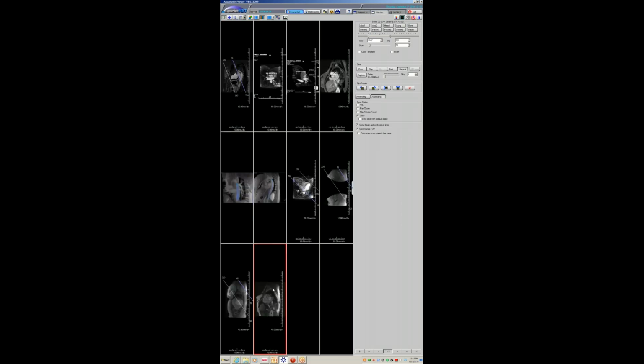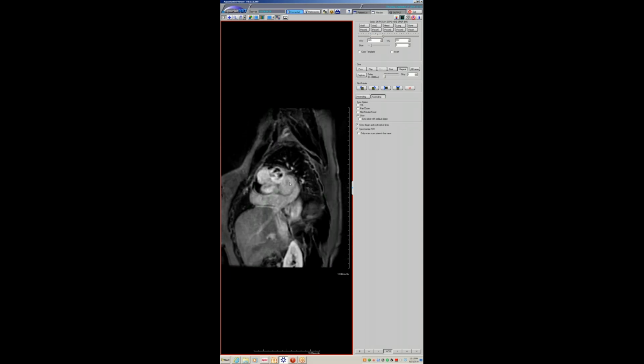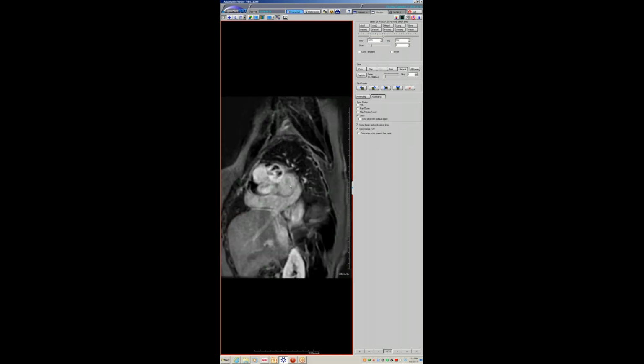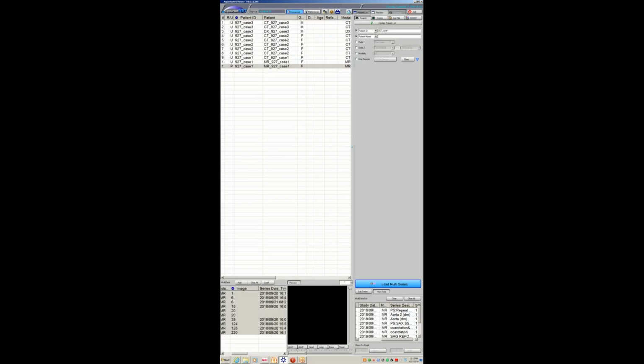And then there was the delayed enhancement imaging. And you can see there's this lesion here with intense peripheral delayed enhancement and central quite low signal, consistent with either fluid or thrombus. And again, they were thinking, oh, it's going to be left atrial. And I'm like, geez, guys, that kind of looks odd. Initially, I was going to think it was going to be a paraganglioma, given the SSFP characteristics, but this changed my story. There's a lot of fibrosis around it.